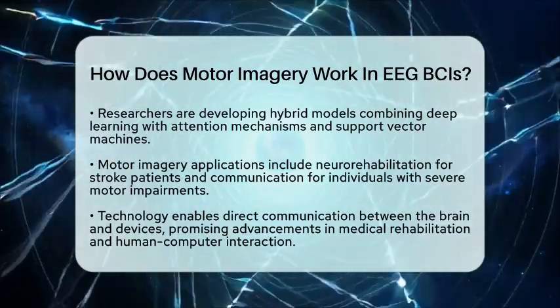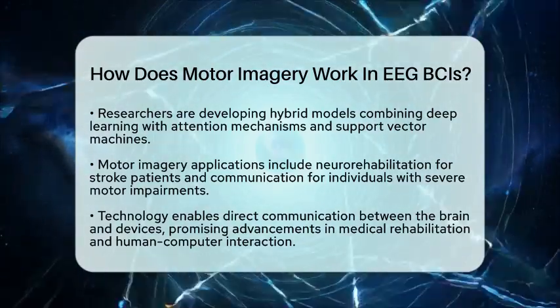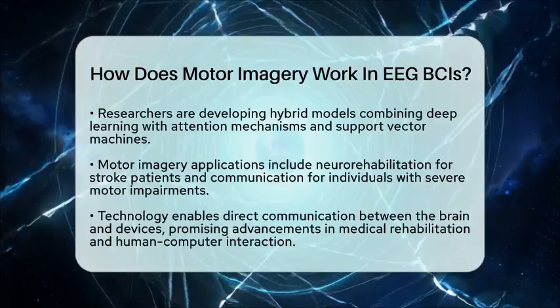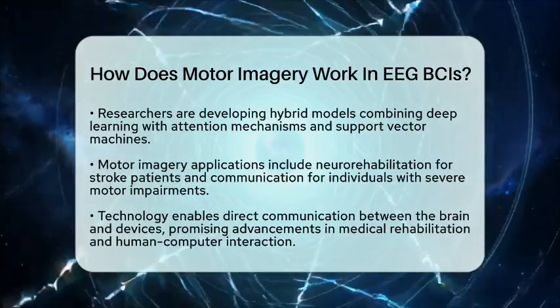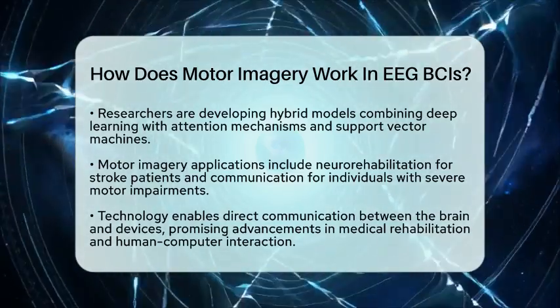In essence, motor imagery works in electroencephalography-based brain-computer interfaces by detecting and decoding brain activity patterns created during the mental simulation of movement. These patterns are processed through advanced algorithms, enabling direct communication between the brain and devices. This technology holds promise for medical rehabilitation and improving human-computer interaction.